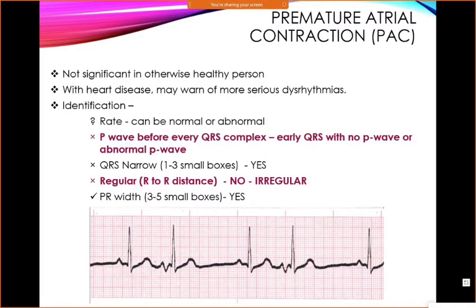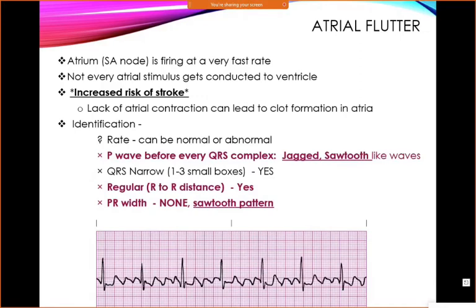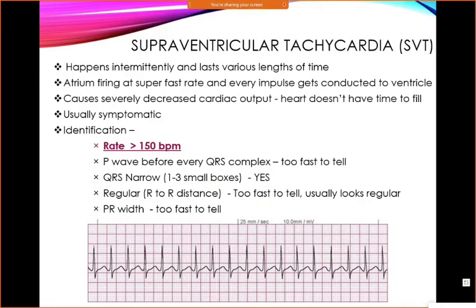Here we have some atrial. Like I said, I'm not in love with this one. I might even call this one a block because of its low rate. I will find you another PAC one, and I have one to show you. This one's AFib. This one's a flutter. And we put this one here.